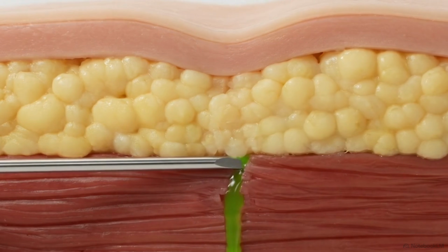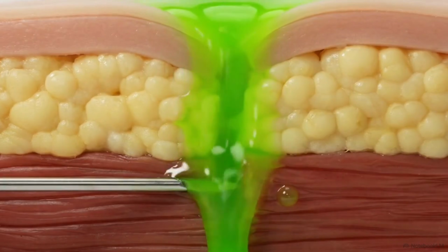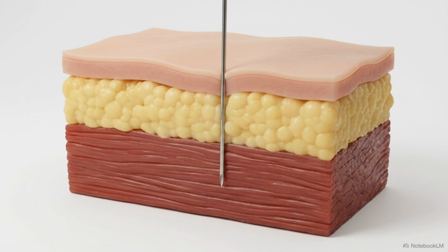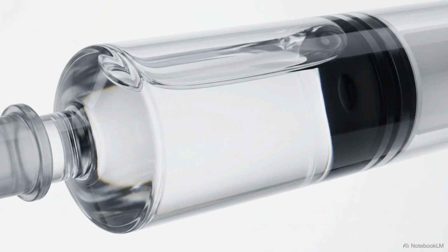Releasing traction too early shears the tissue as layers snap back. This breaks the seal, allowing medication to leak into the fat layer. You must maintain this firm lateral tension from the moment of insertion until the needle is completely removed. Using a swift, dart-like motion, insert the needle at a 90-degree angle to puncture the displaced tissue and reach the muscle. If protocol requires aspiration, pull back on the plunger for 5 to 10 seconds to confirm the needle has not entered a blood vessel.